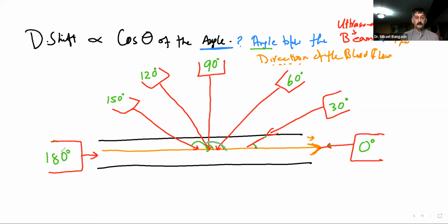Between what? Between the beam and the direction of the blood flow. Because this here is 180 degrees. Did you girls get that?